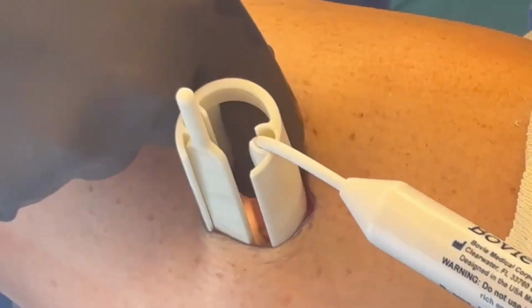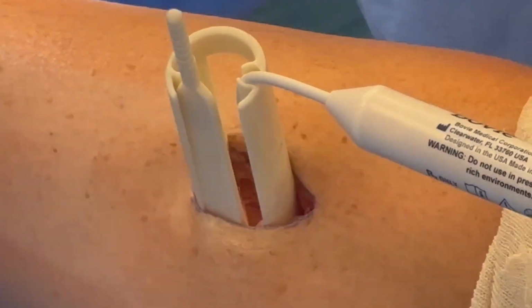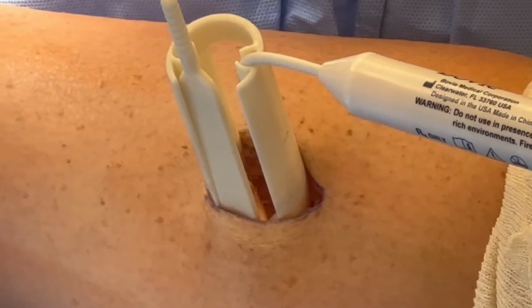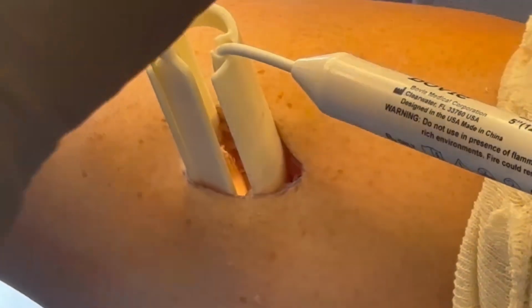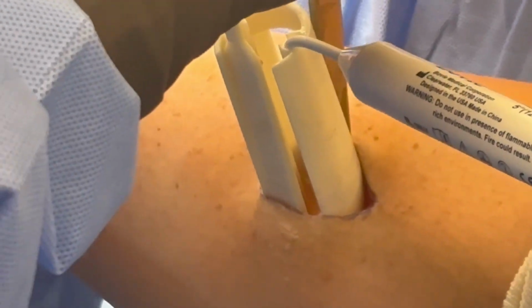And you can see the orientation here of everything with the light and the backstop in place, and then the cannula providing direct visualization. Next, somebody's going to dorsiflex the foot and lift the leg up off the table for you. And we're going to take a long handle 15 blade in from the top opening in the cannula and release the deep fascia from lateral to medial against the backstop, protecting the underlying musculature.